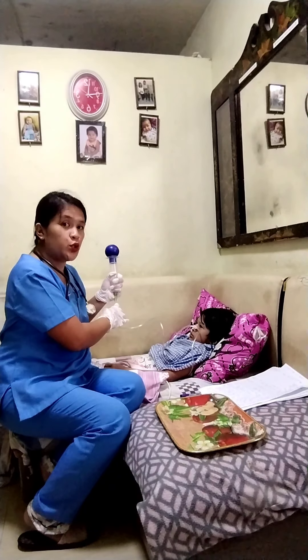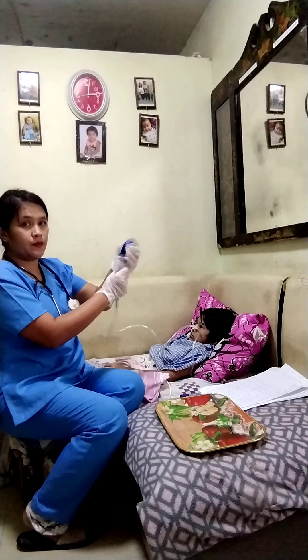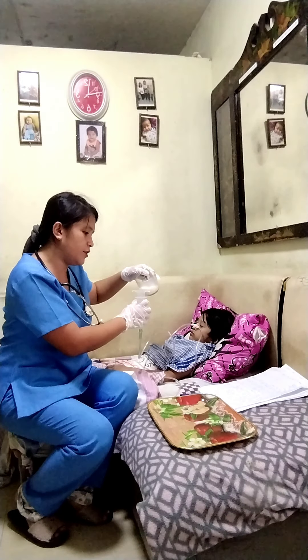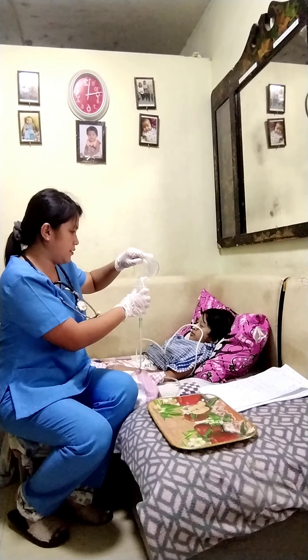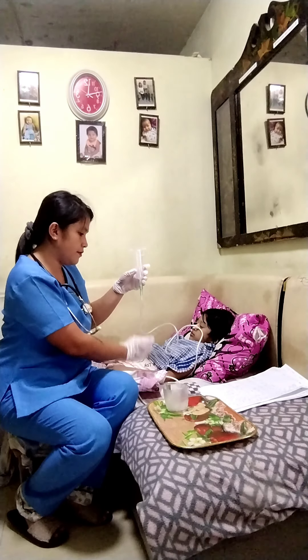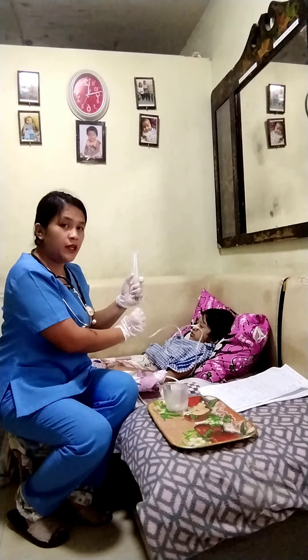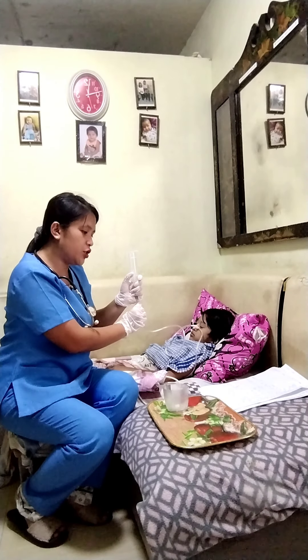Next, we're going to clamp the NGT tube and remove the rubber bulb of the Asepto Syringe. Now we're going to put our formula, avoiding the entrance of air to avoid excess air to the stomach. Elevate the Asepto Syringe at 12 to 18 inches above and evaluate the insertion site while feeding.